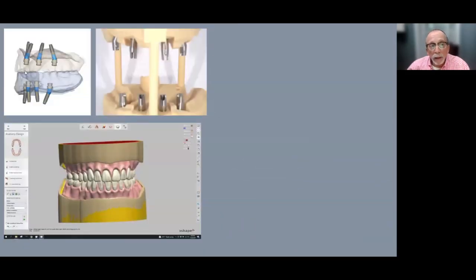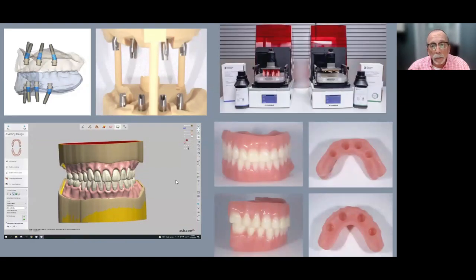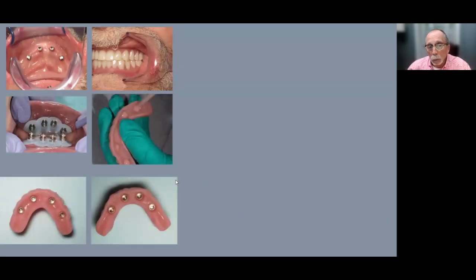So with that data, now I have everything I need to know to make the denture. So we can get the abutments ordered, we know where to put the teeth, we know how to get everything done, so we can print or mill, complete the final dentures digitally, and then at delivery, it's a 2 appointment process. And again, I say 2 appointments. Obviously, the implant placement, the healing, and all that, some more appointments. But when we get to the point of we're ready to go, we can do it in 2, and it works really well.